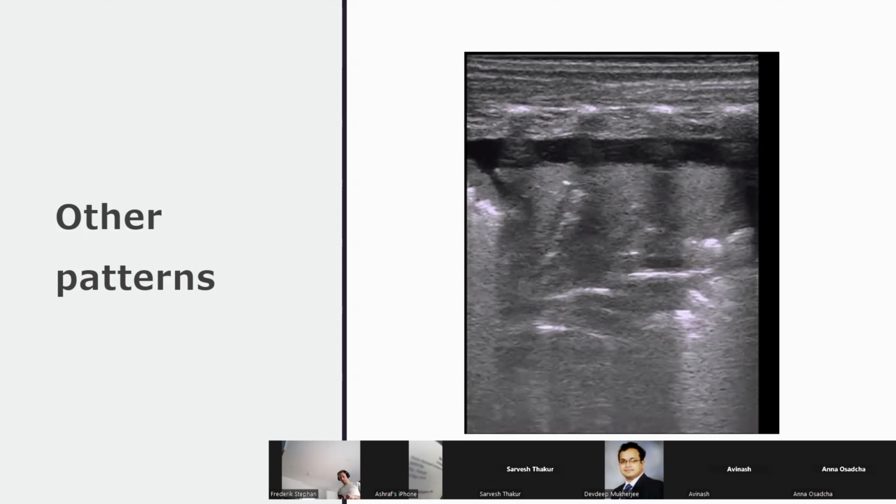It's quite focal as well. But the clinical condition of the baby, its blood pressure, its ability to tolerate the recruitment maneuver is quite important. Now, the different things that you could do in this situation, naturally, you could go up on PIP, you could go up on PEEP, you can increase inspiratory time, you can oscillate this baby.